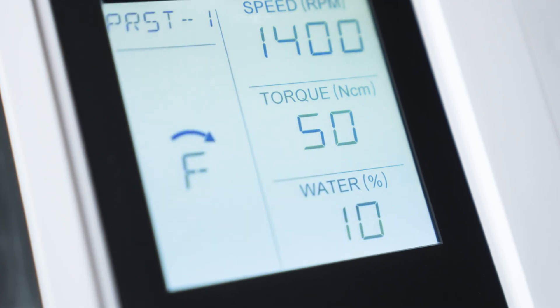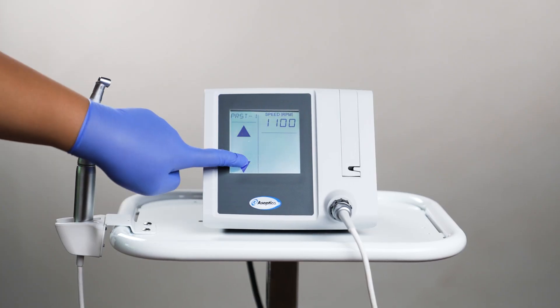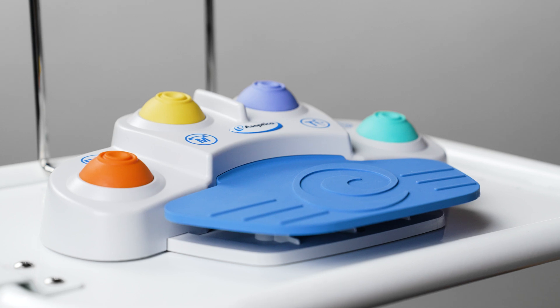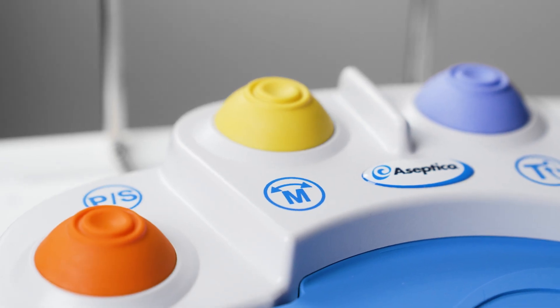The system has an intuitive user interface and a large, easy-to-read touch screen display that allows you to quickly adjust the motor settings, including speed, torque, irrigation, motor direction, and the presets. The included multifunction foot control further improves efficiency and infection control by providing hands-free adjustment of most motor settings without having to touch the display during the procedure.